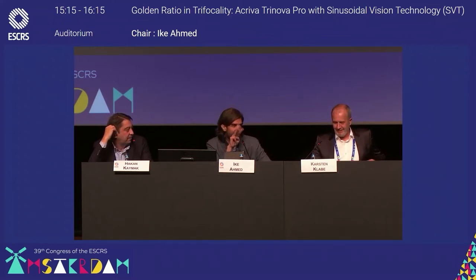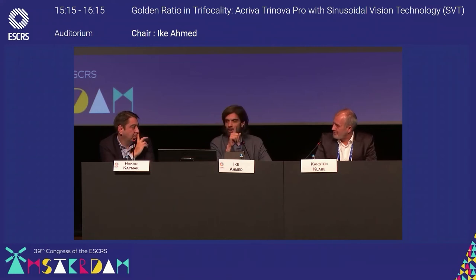Okay, let's go through this. Great questions. Thank you. Absolutely. Great questions. So first question is on your preferred formula for this platform. Barrett Universal 2.